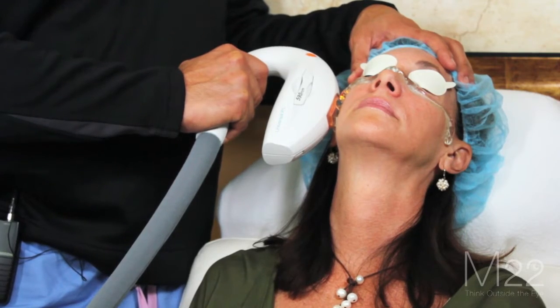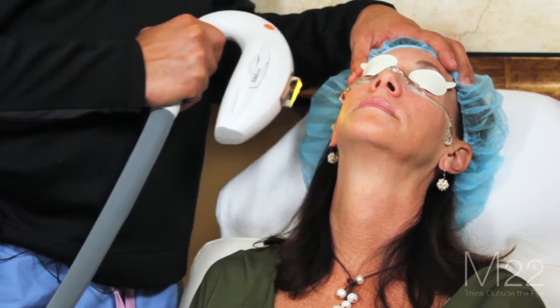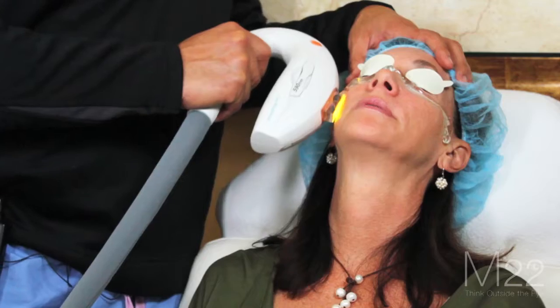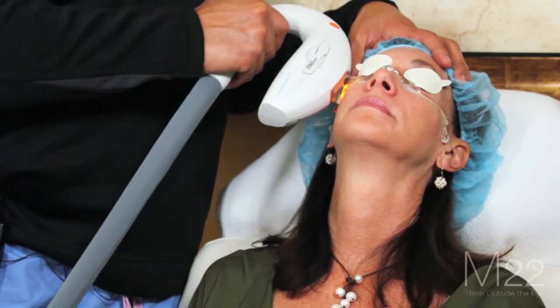Warn the patient on the first one — count down for them. Then we start treating.